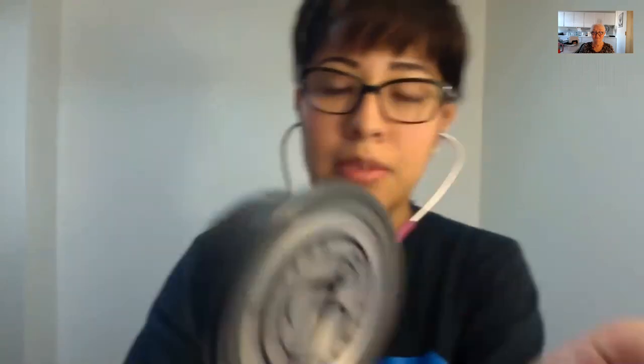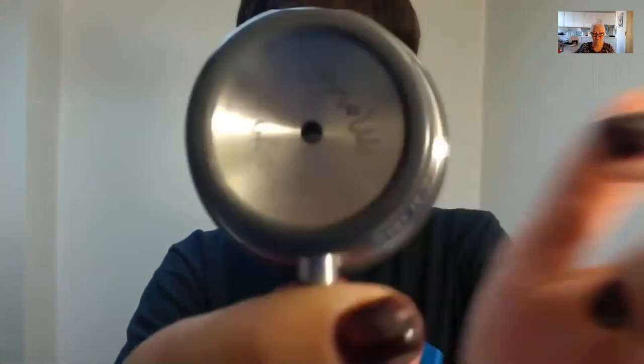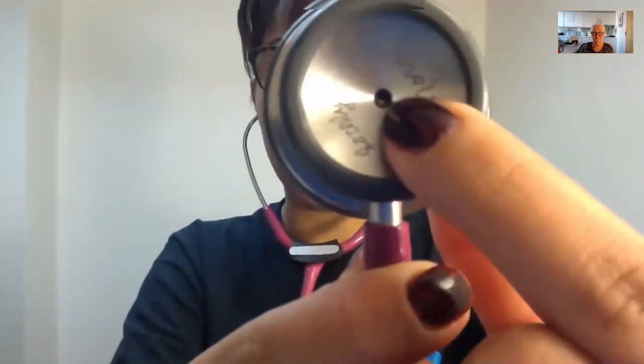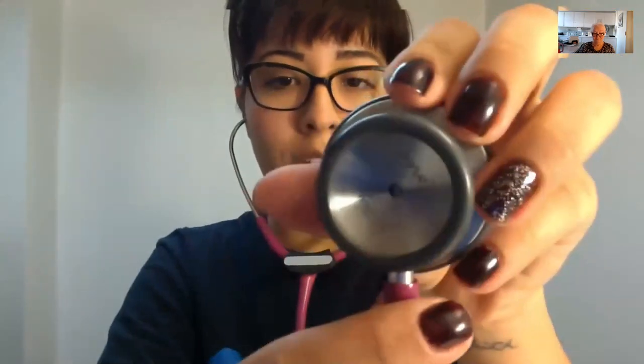And so when it comes to taking somebody's blood pressure, if your bell is open, which you can see there, see the hole, you can't hear people's blood pressure when you put it down their arm. And so before you take a blood pressure, you want to make sure that your bell here is closed. If you have a stethoscope now and you want to put it in your ears and try this out so you know what I'm talking about, you're more than welcome to.